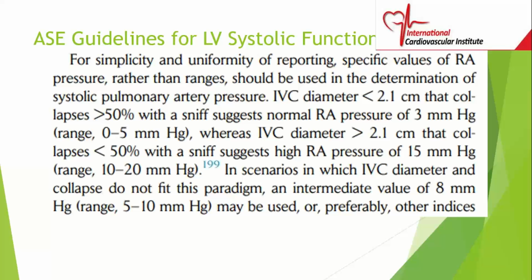So this essentially concludes chamber quantification. You guys need to read the ASE guidelines, well, it's the same thing, but read the manuscript, and this is what you should be doing when you're doing your studies. Not only that, but this is what you're going to be tested on. Just the guidelines. So you should know the guidelines.